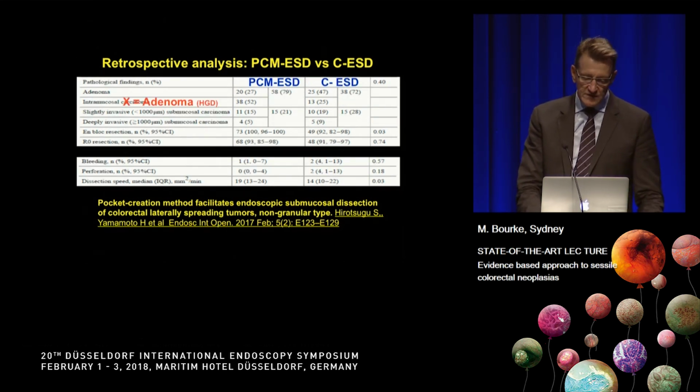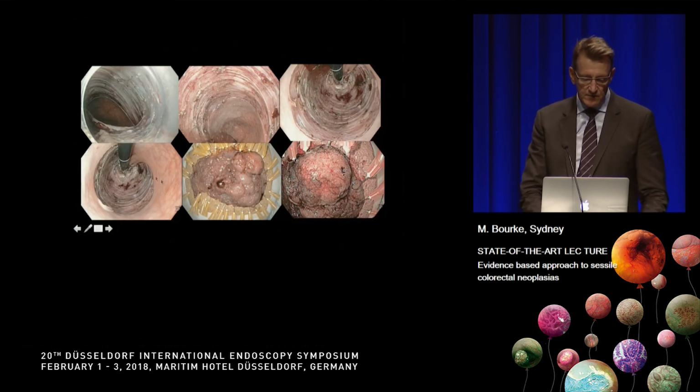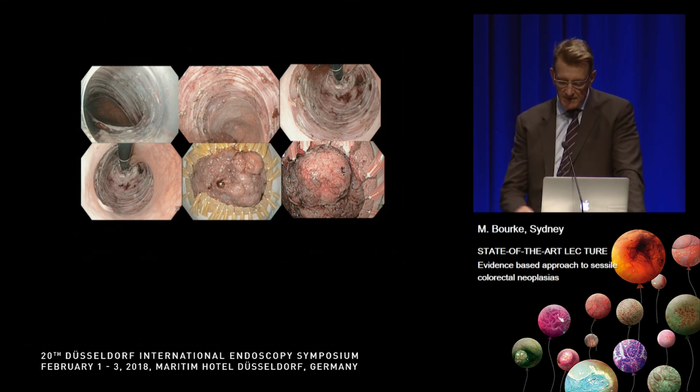So we also do this technique in some select cases, like so, for a huge rectal lesion involving most of the circumference, large nodules, 2A, 1S, granular mixed nodular, perhaps best treated by ESD. And here's another example, treated in that way. And also this is traction-assisted ESD, I think, which will revolutionise the technique, make it much faster.